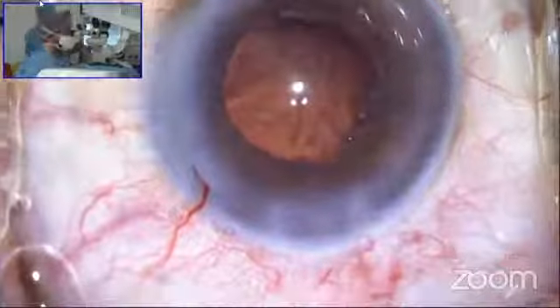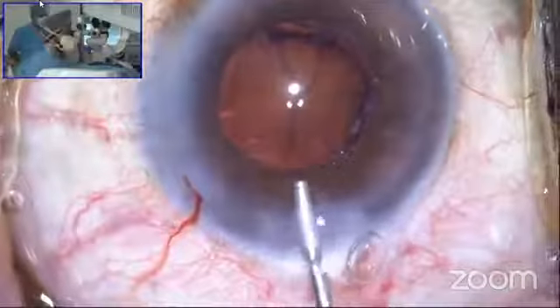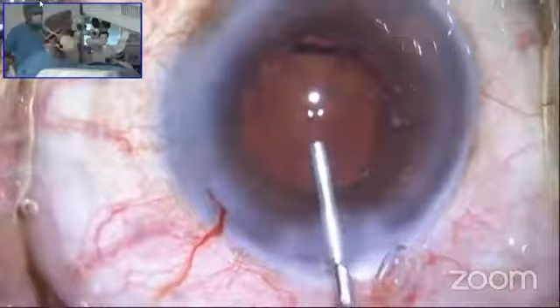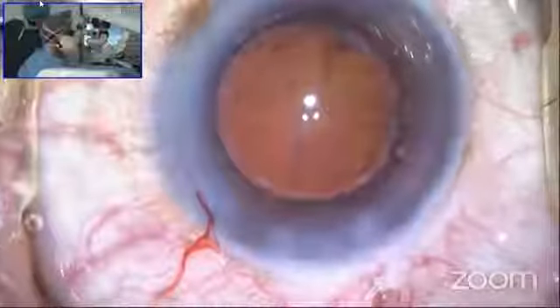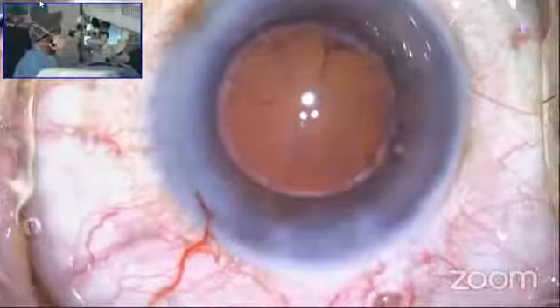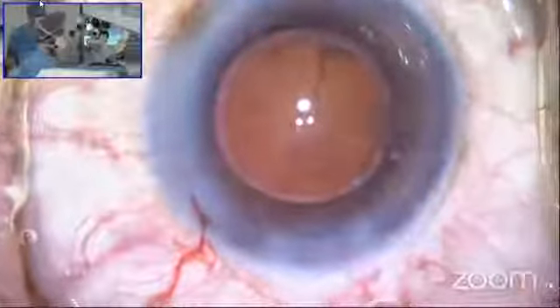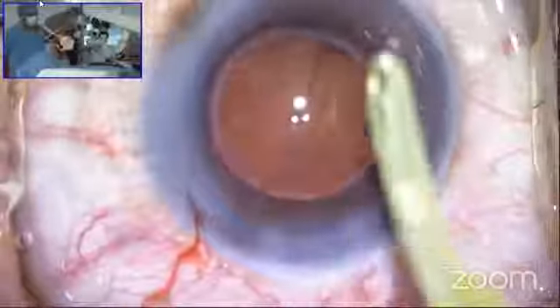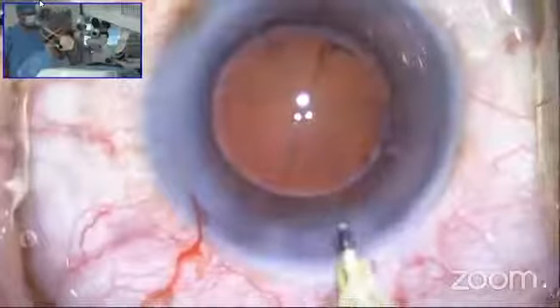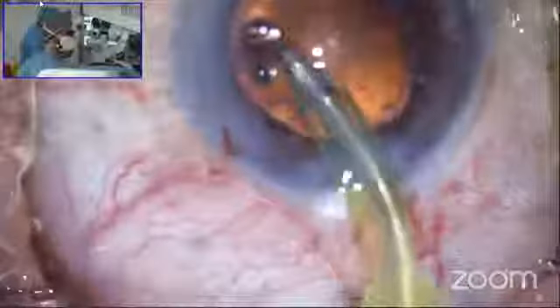The EPT we have used is 2.5 seconds. You can see a good red reflex. The only thing here is that you have to go below the red reflex to do the aspiration because the cortex has got cleaved due to the laser.